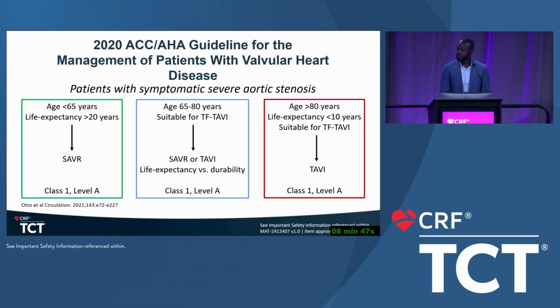The question is, sometimes we're being just too aggressive about commissural alignment, and there are certain cases that just don't need to be aligned. And if you use the proper platform, you don't have to align them. So can I just add maybe something to that? We've been doing intraannular valves for years, and they've never been commissurally aligned. And we've never been worried about it, and I don't think we've seen any downside to it.